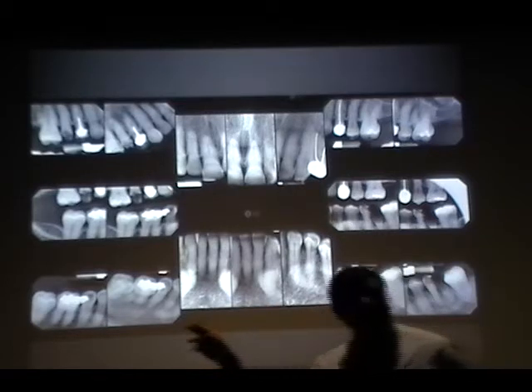We have too much of the apex visible, and we're missing the crown of 8 and 9. Yes, so 8 is also missing. We should be able to capture the whole of 8 too. And the interproximal. Yeah. Placement issues, right? Next.